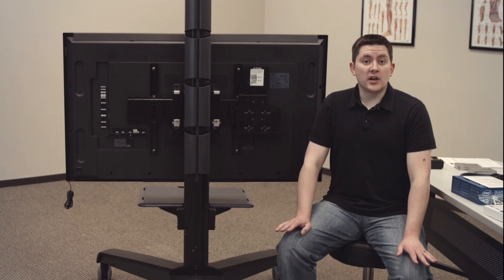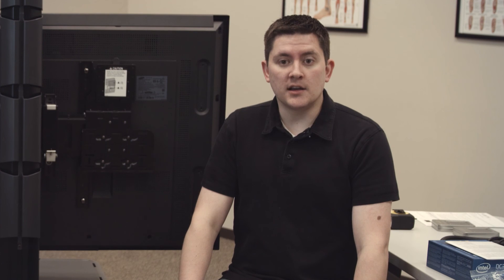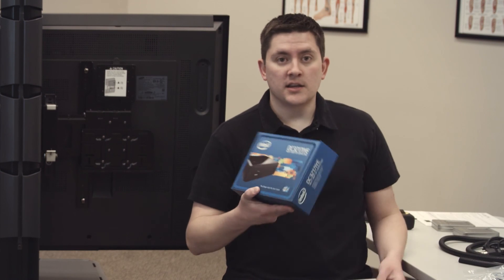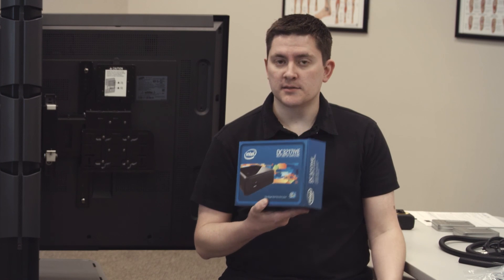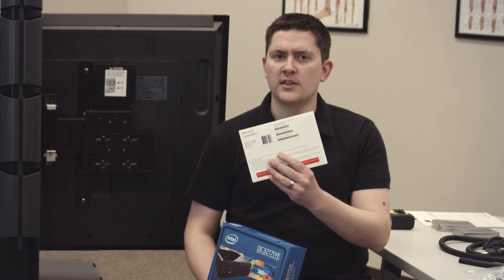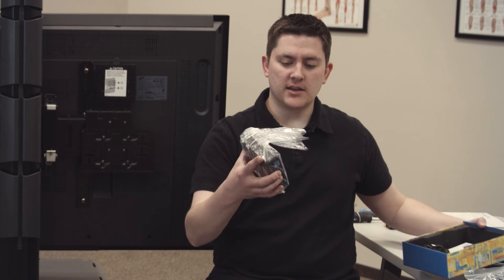I've checked the contents against the labels, I know I have everything I need, and I've taken everything out of the box so it's easier to get to. The first thing I'm going to do is mount the PC — that mounts right here. You're going to get an Intel NUC computer; it's going to come in a box like this. You're also going to have your Windows software — you don't need to do anything with that, we just send it to you. The computer comes in a bag like this; just remove it from the bag.